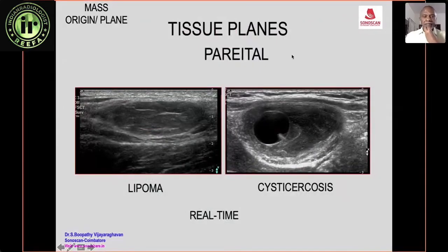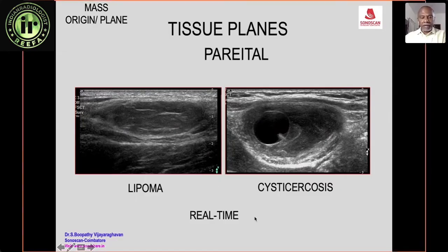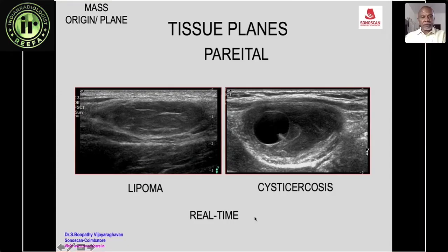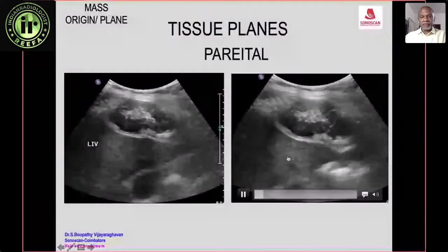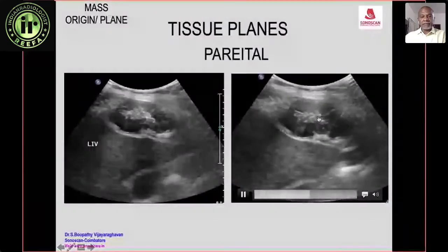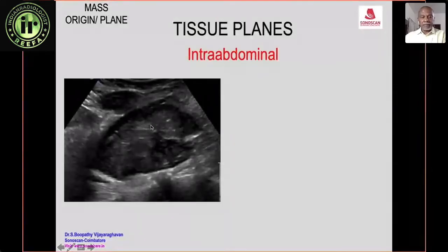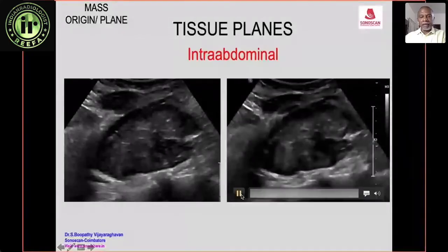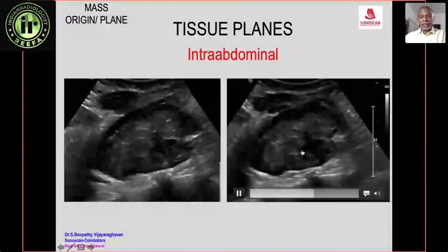Tissue planes help differentiate parietal from intra-abdominal masses. Parietal masses such as a lipoma and cystic cysticercosis are clearly within the abdominal wall. In real time, parietal masses do not move with respiration, whereas intra-abdominal structures do — confirming a parietal mass. An intra-abdominal mass shows clear respiratory movement.